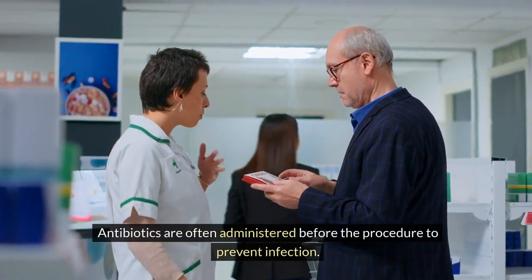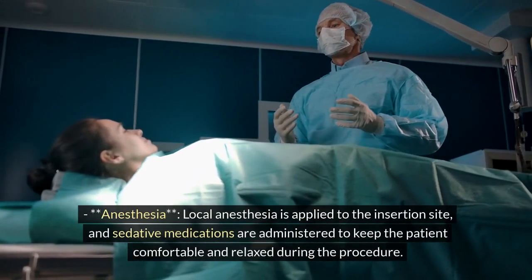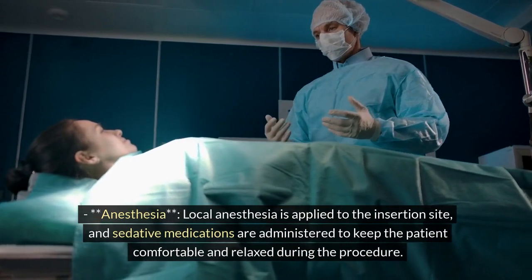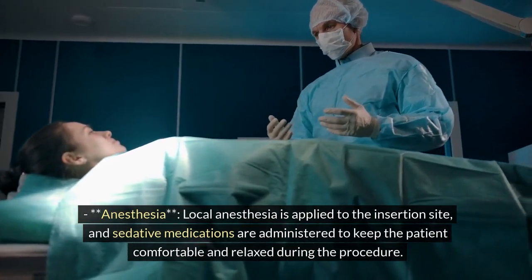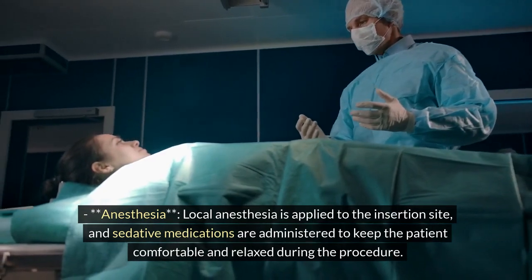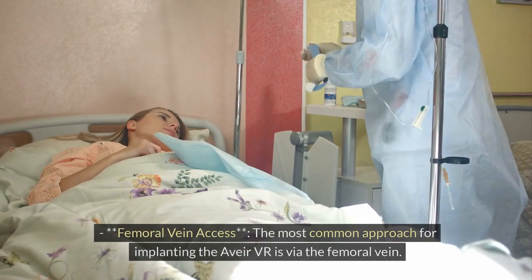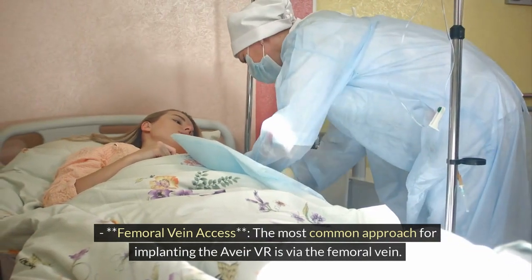Antibiotics are often administered before the procedure to prevent infection. Anesthesia: local anesthesia is applied to the insertion site and sedative medications are administered to keep the patient comfortable and relaxed during the procedure. Step 2: Vascular access. Femoral vein access: the most common approach for implanting the Avia VR is via the femoral vein.